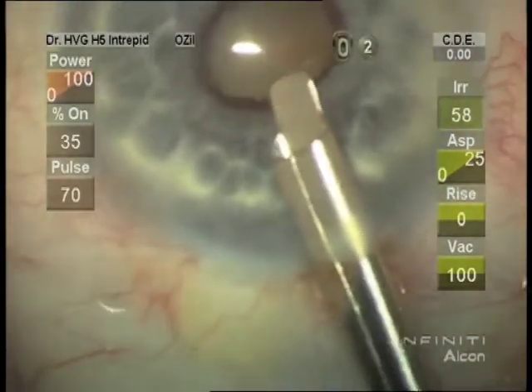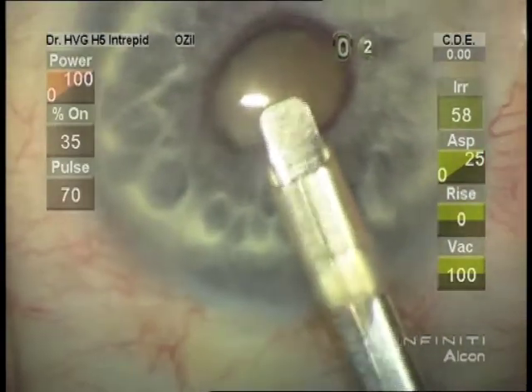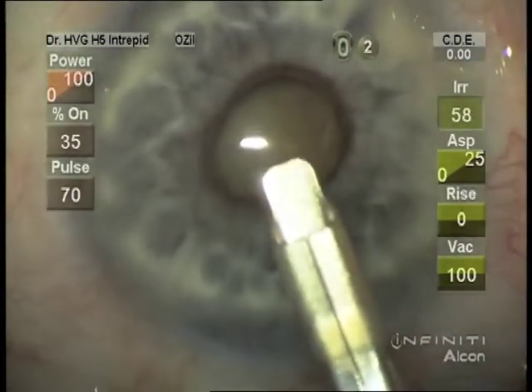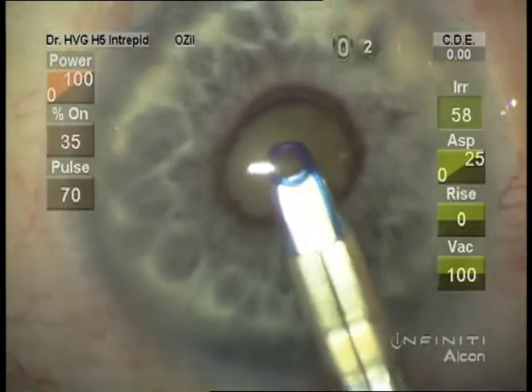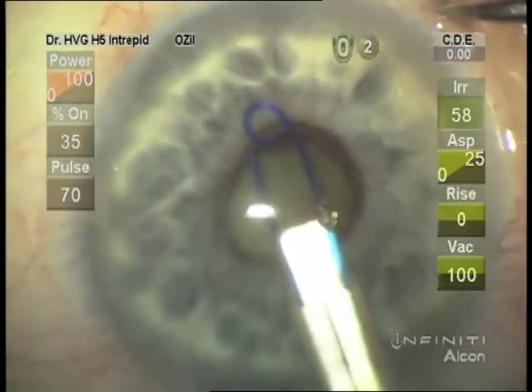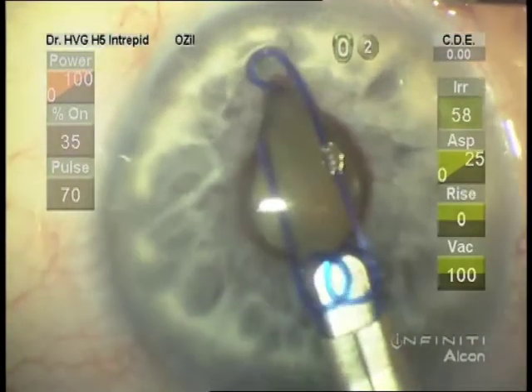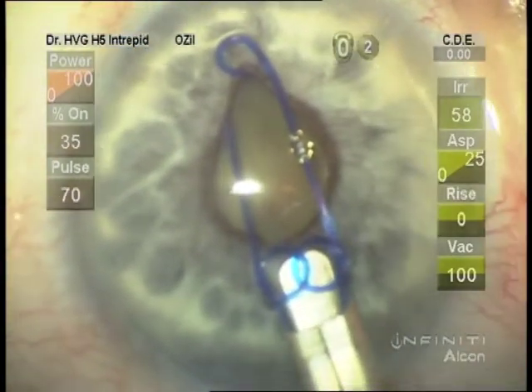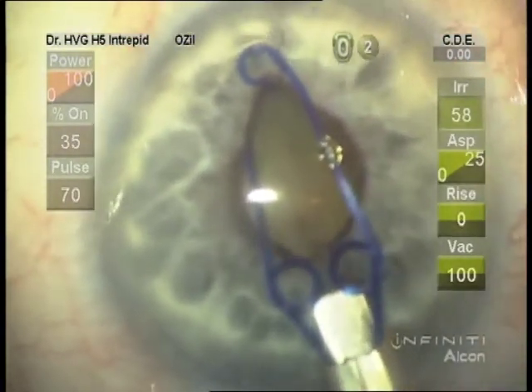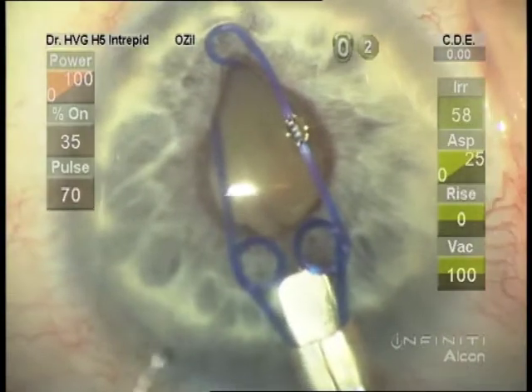I don't always put this upside down, but the wound was probably objecting there and I did the rotation. It can be a little tricky to get the loops engaging the iris.